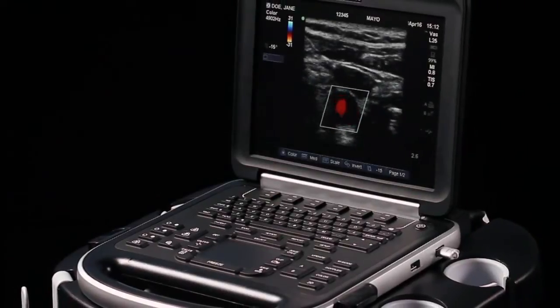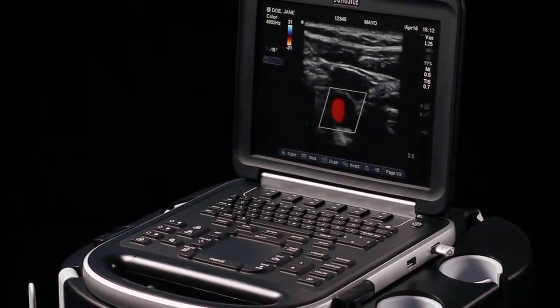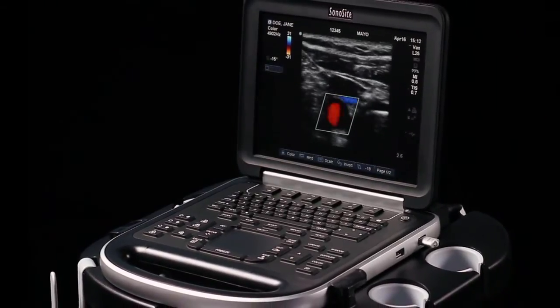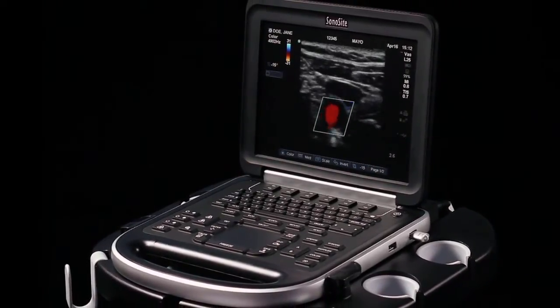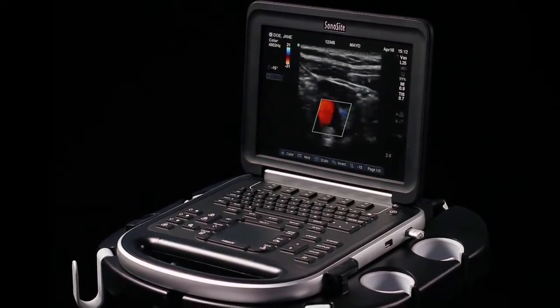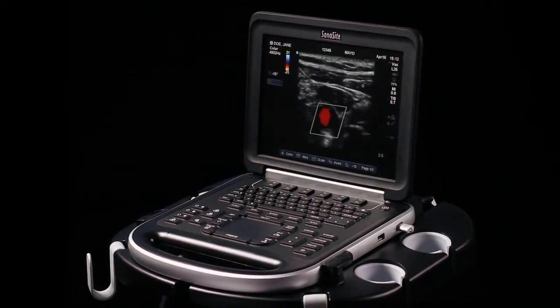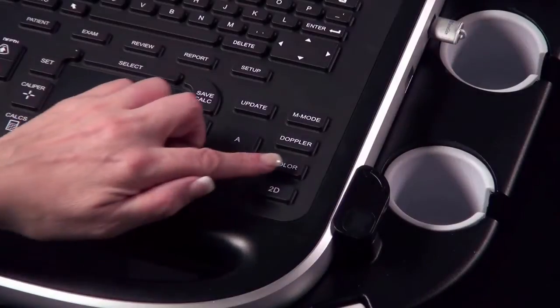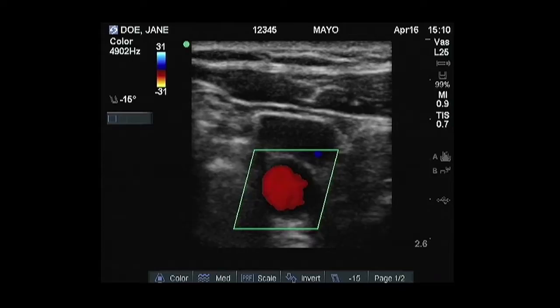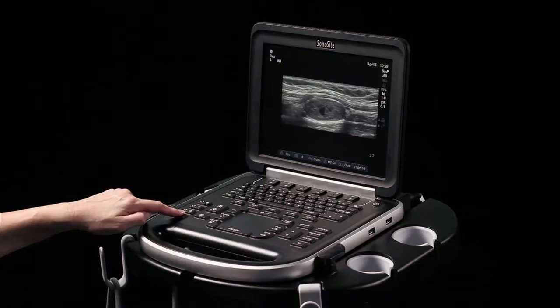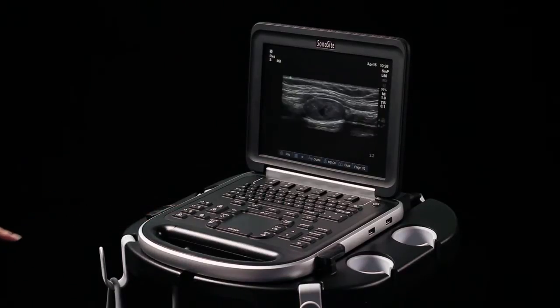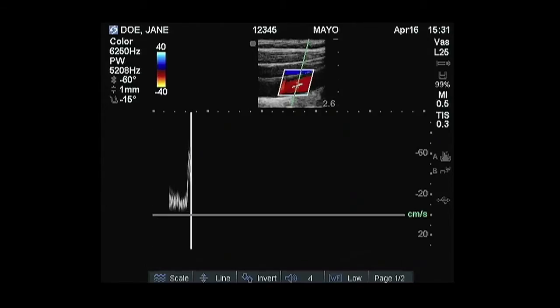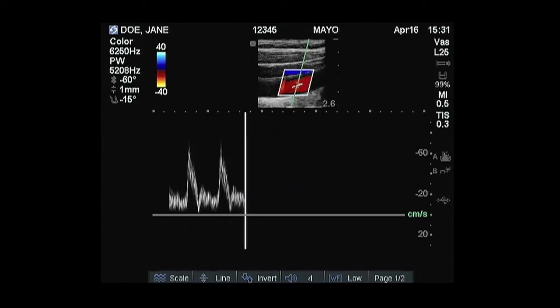The Sonosight Edge offers superb image quality and increased speed, along with Sonosight's traditional reliability in a laptop-sized unit. This short video will demonstrate the key features and functions of the Sonosight Edge system. For more in-depth information, please refer to the system user guide.